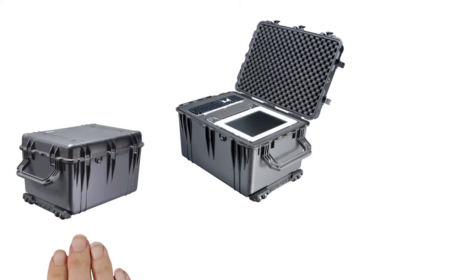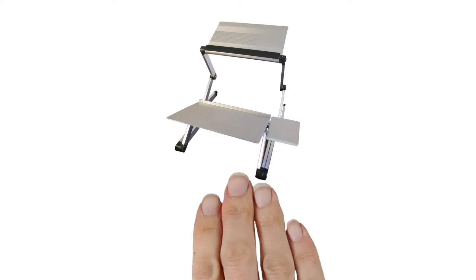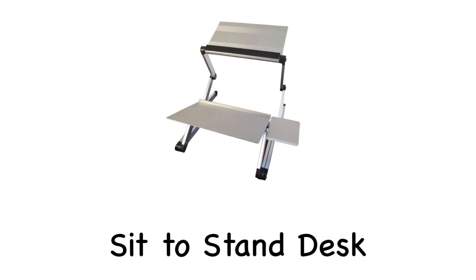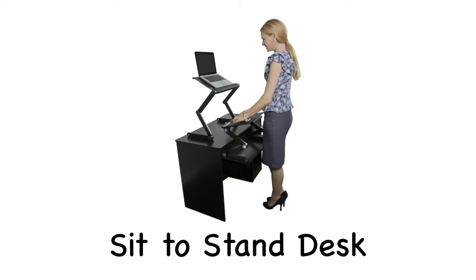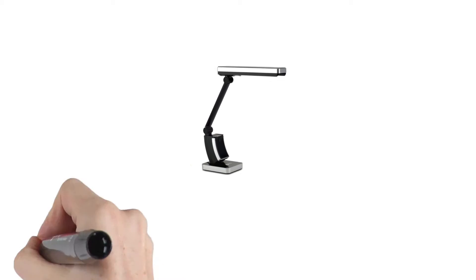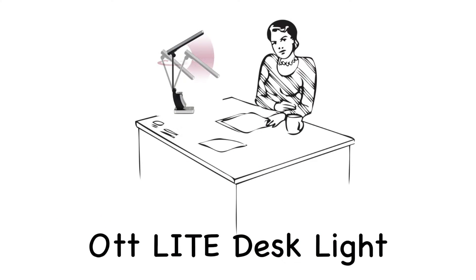Each kit will have the same items that will fit nicely in this sturdy Pelican case. There will be a sit-to-stand desktop desk. This will fit on top of a desk and gives the user the ability to sit while working at the desk or even stand. You will also find the OttLite desk lighting. This is a more natural, less harsh lighting in case someone needs more lighting to read by.